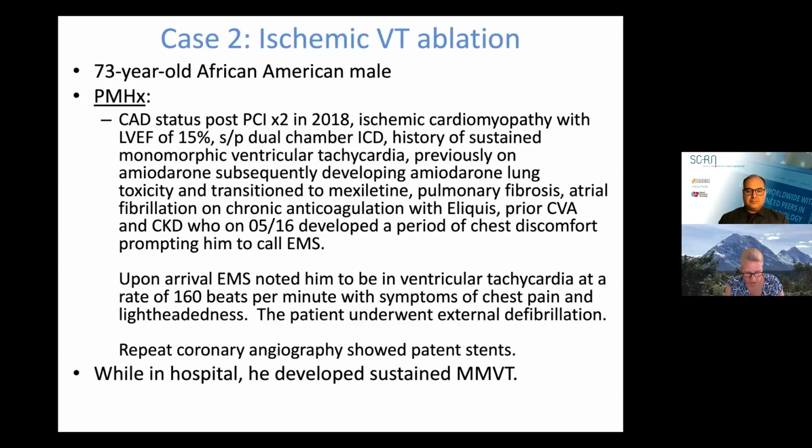What we learned is that if you want to avoid suddenly having some V pacing, you program the ventricular lead capture output so far down that you cannot capture at all. That is extremely safe for someone who is not pacing dependent, of course. In someone who is, you have to have a different pacing lead essentially.